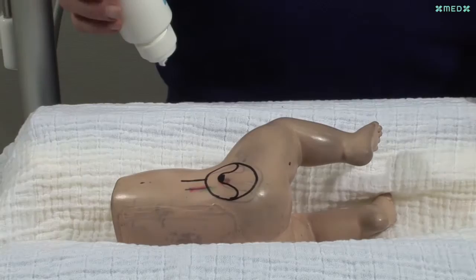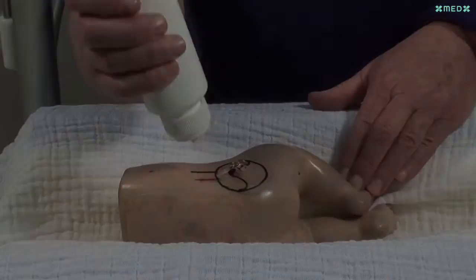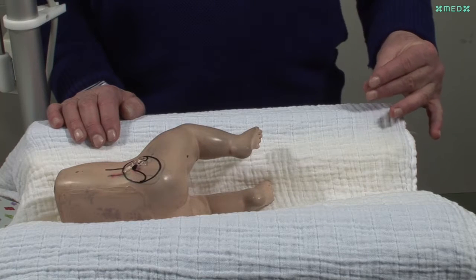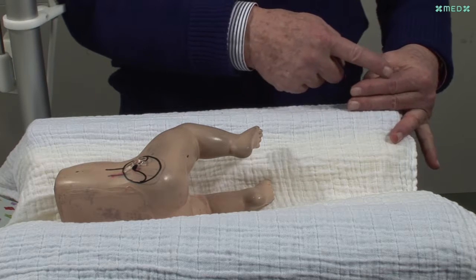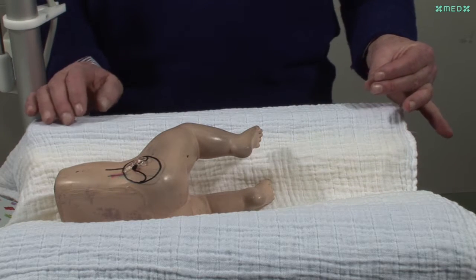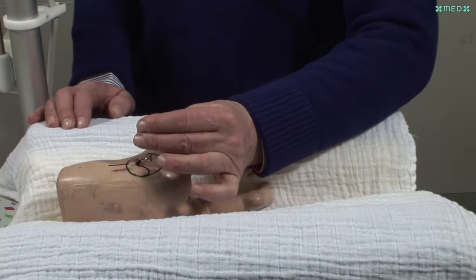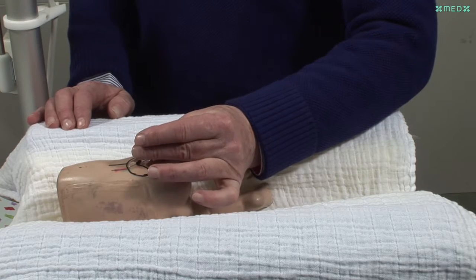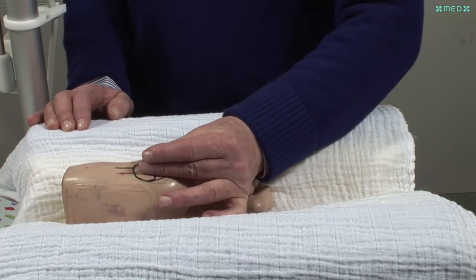The warm jelly is placed onto the baby's skin and not onto the transducer. At the beginning of the examination, the middle and the index finger are straight and parallel to each other, and the tip of the thumb touches the tip of the middle finger. In this position, the fingers are gently placed into the jelly on the baby's skin without too much pressure.